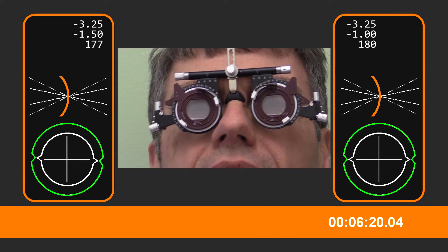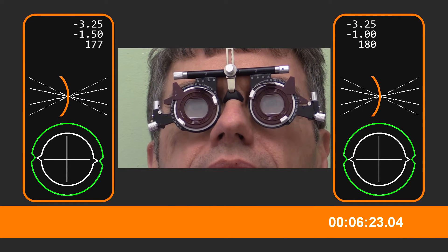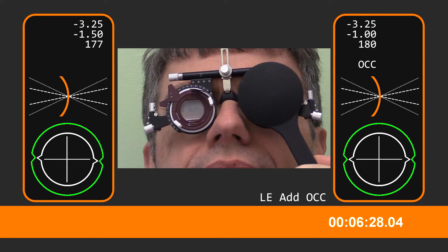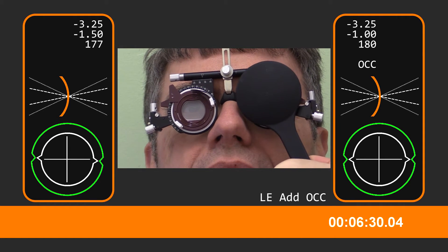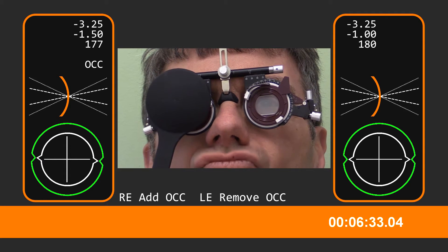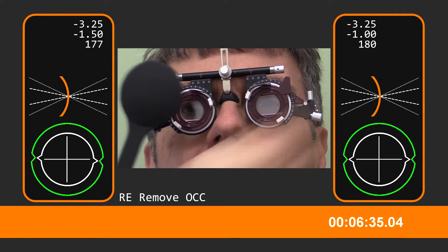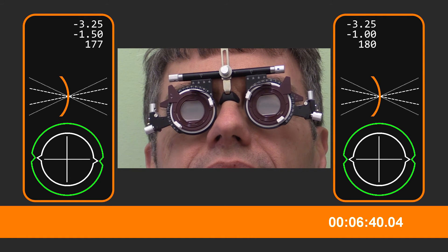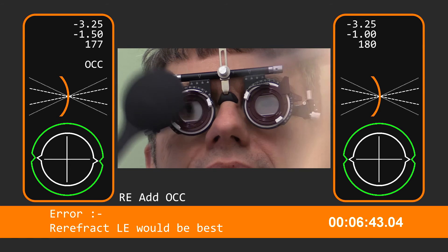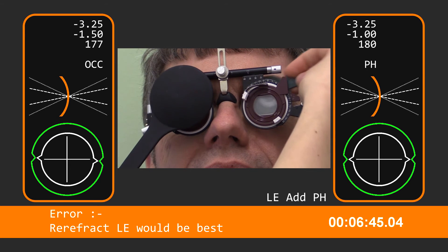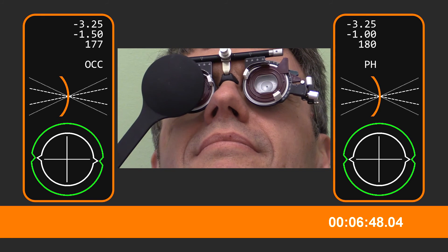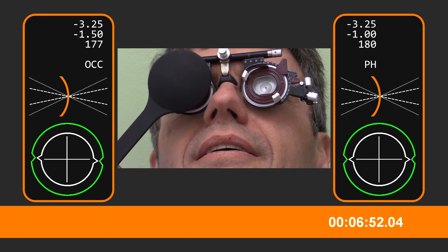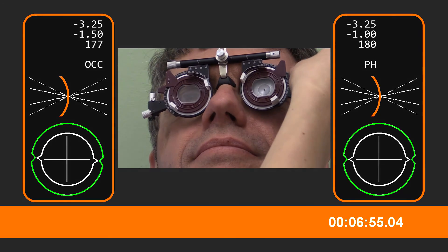How's that looking? Looking really good. Yeah, nice and sharp. Yeah. And you'd still be able to read the bottom line? Yeah, easily. Yep. And if I covered that eye, would you still be able to? Yep. And there. And there. I don't know if it was the other way but yeah. Okay. If I were to put my lovely little pinhole in front there, can you see any clearer with that pinhole? Yeah, you have to adjust it a little bit. Or is it about the same? It is about the same. About the same. Okay.